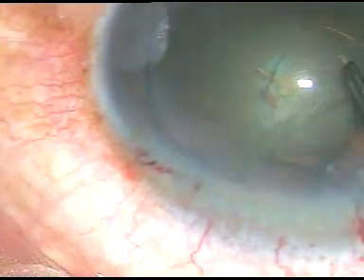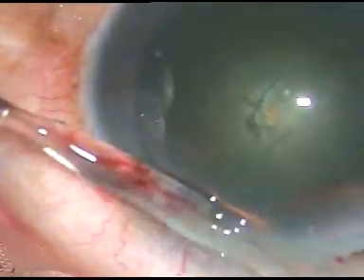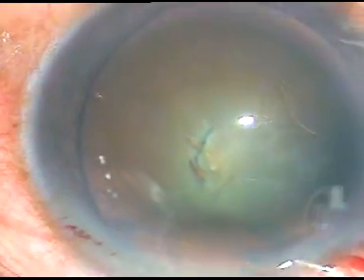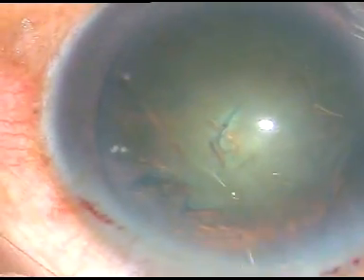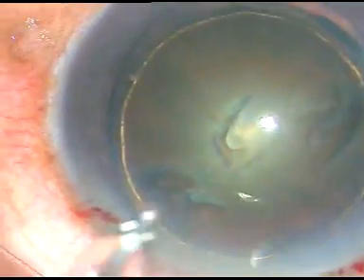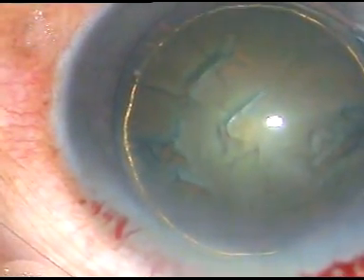Once capsulorrhexis is done, now is the time to do hydrodissection. Hydrodissection is done with Ringer's lactate or BSS. The fluid wave is passed just underneath the anterior capsular rim. I had bounced a little bit towards the equator — this is not good, so I go to the other side. The fluid wave comes to the other side. Hydro delineation has also been done, and we can see a beautiful golden ring in this case.